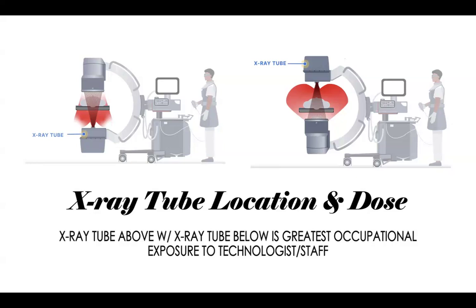We know we can manipulate the C and put it at a 90-degree angle. So that means turning that C all the way around and getting us a 90-degree angle. But the X-ray tube above the patient and the image intensifier below the patient is going to be the greatest occupational exposure. So this position right here, where you have your X-ray tube above your patient, image intensifier below, there should never be an instance where you use this.